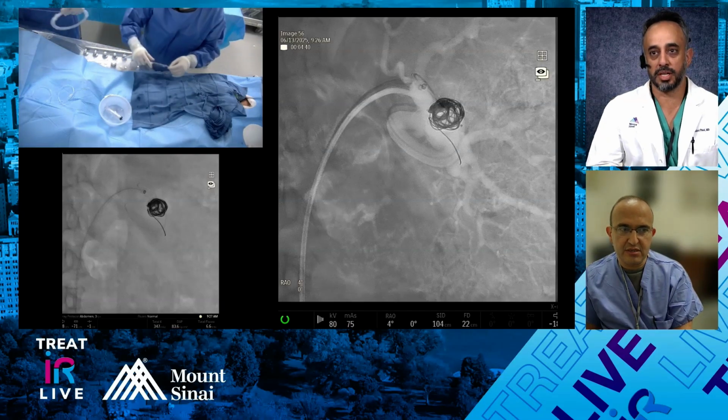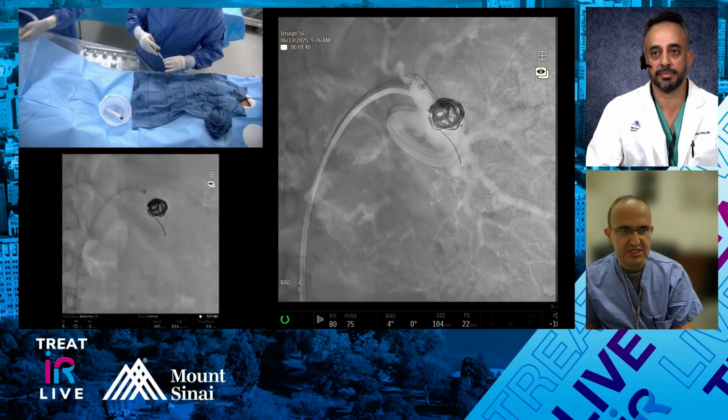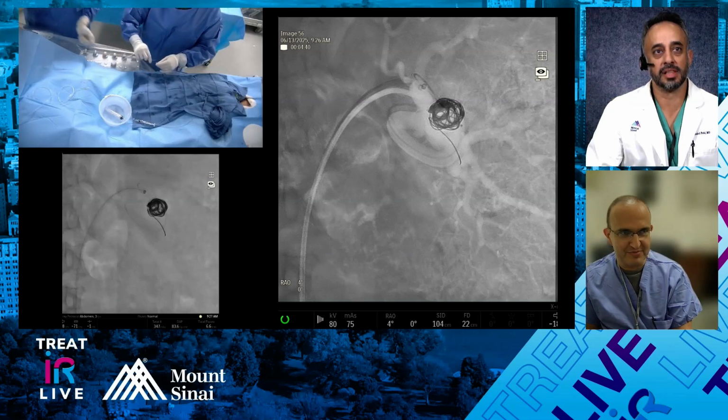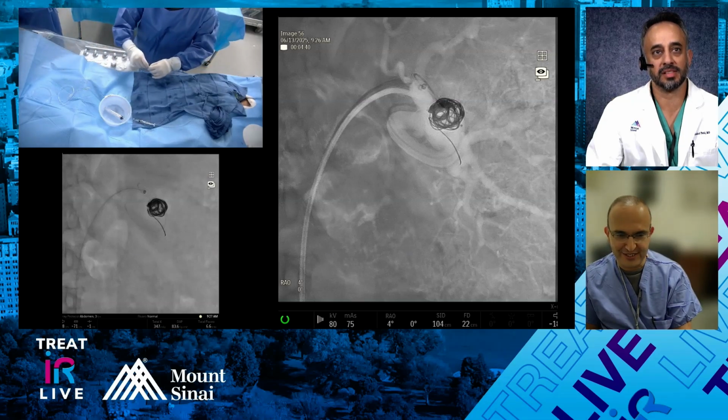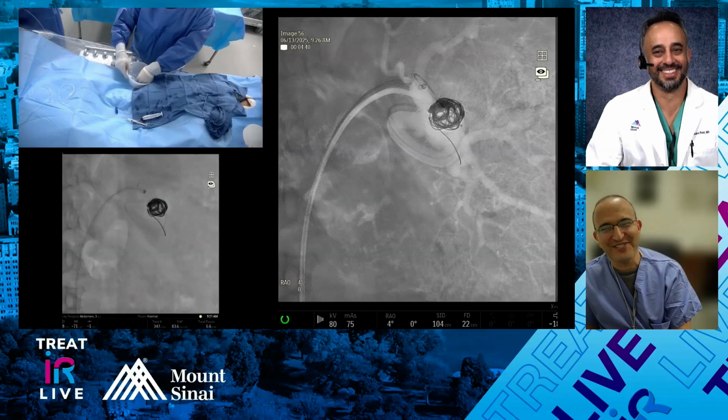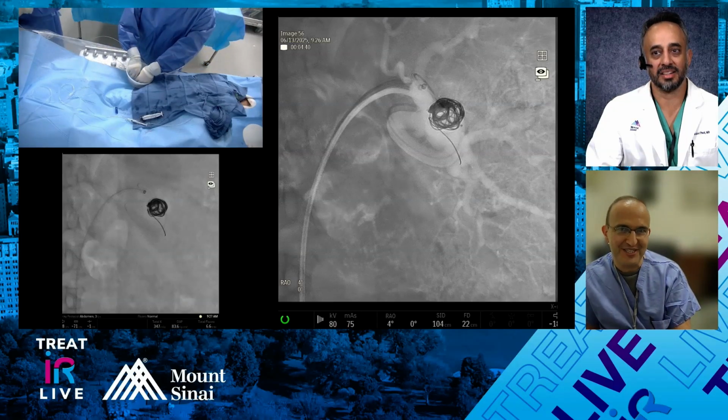I don't know, have you used liquids? No, exactly, just like you said too. I'm a little bit impatient too, as Ed knows, so I put in all of the coils, and when you get near the end, as long as I feel like it's not going to go distal, then I'll start using a little bit of gel foam or glue to shut it down.